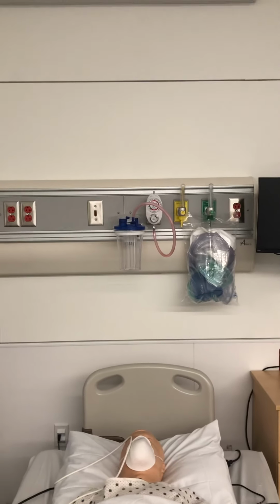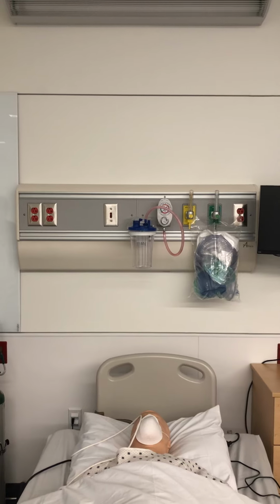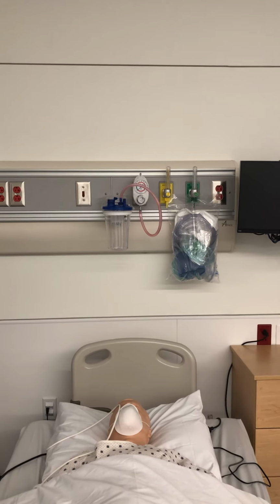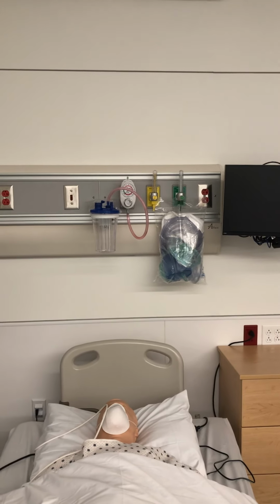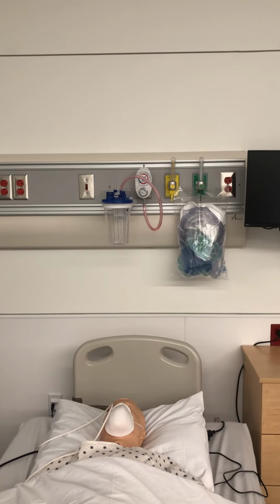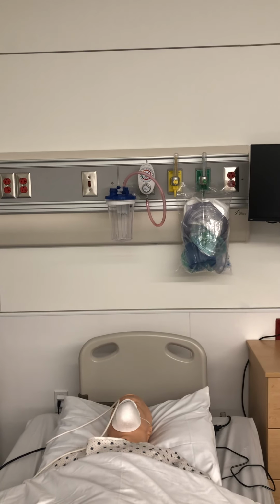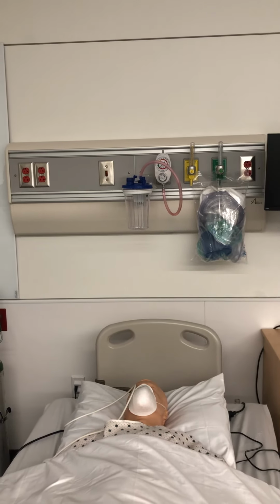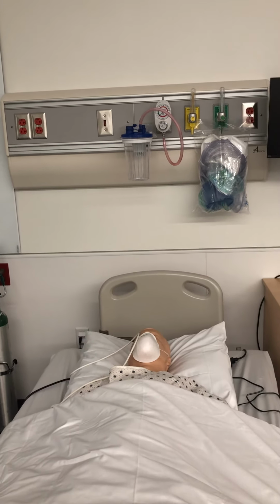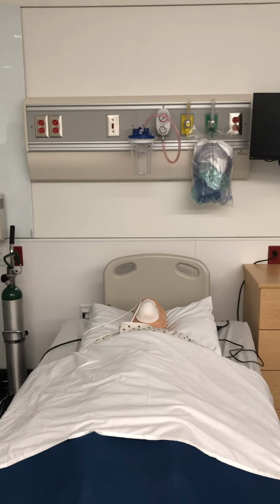Along the top of the bed, you see some equipment. These are called head walls. They include oxygen, medical air, suction, and emergency power. Now, in our building here, the red outlets are not really emergency power, but at a hospital, those outlets would be active even if the power was out. That way, for example, if this patient did have a ventilator, you would want to have it plugged in even when the power was out. So that's how we would use that. And this way, our students can all practice how to attach this equipment when they're working in the hospital.